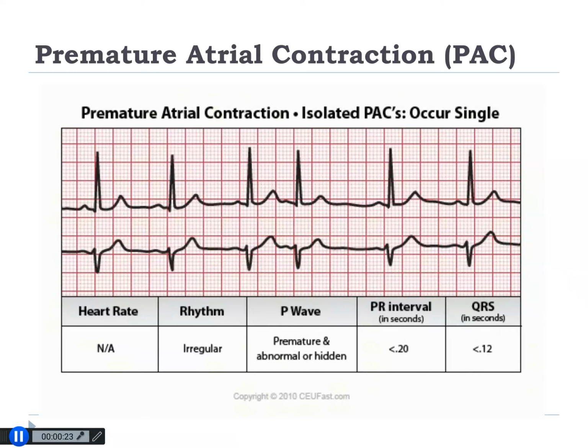And a lot of times they don't come alone, so you might have PACs, plural. So they can occur in isolation, singularly, or we might get multiple PACs, which we'll talk about in a minute. The rhythm is irregular, because the R waves are not coming at regular intervals.